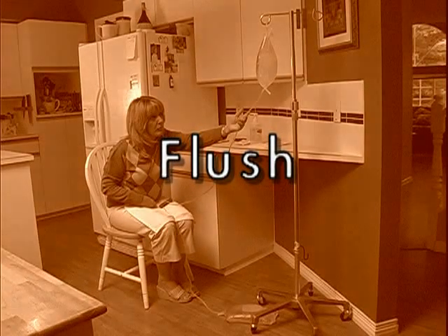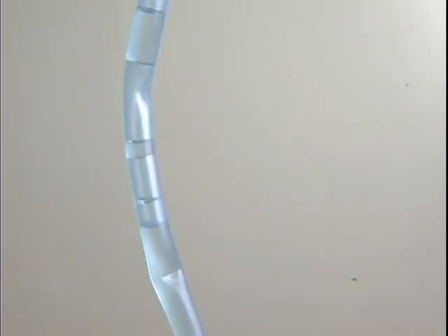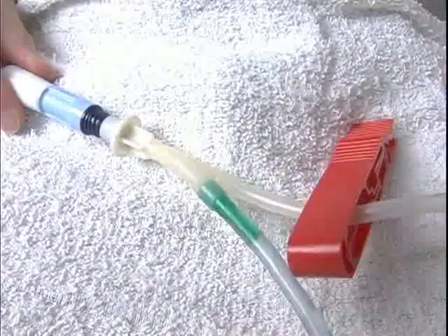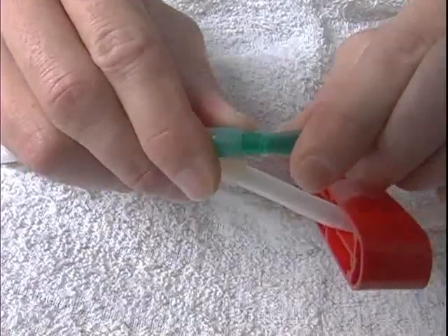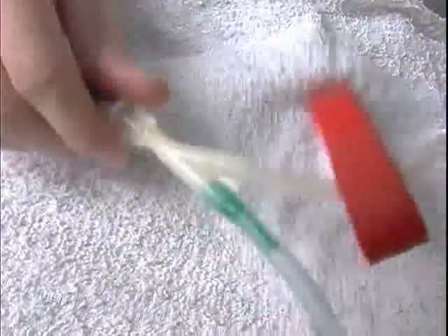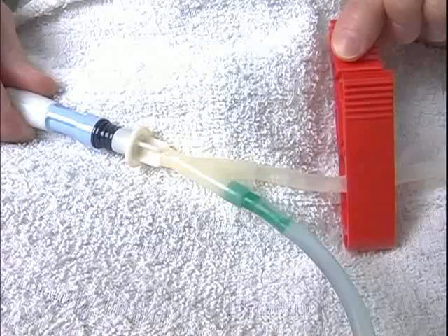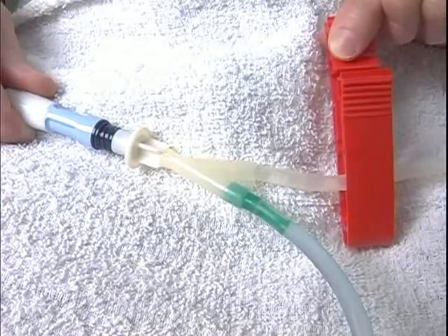To ensure that the fill line is free of air bubbles, it is necessary to flush the line. To do this, break the green plastic seal on the end of the fill line that is closest to the twin bag connector. Grasp the seal with your thumbs and forefingers and break it by rocking it back and forth several times. Open the red clamp and count to five while the air bubbles flush into the drain bag. Then close the clamp again.